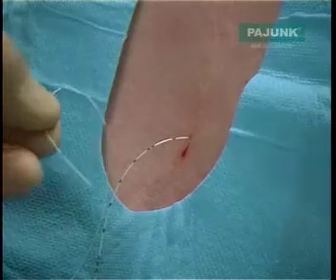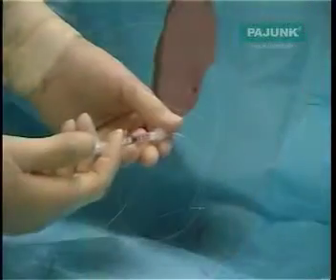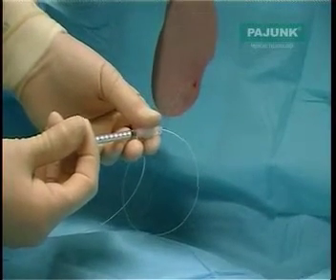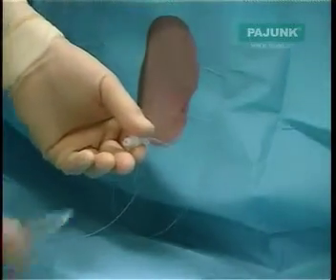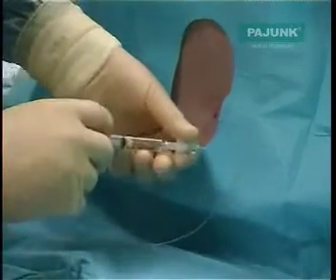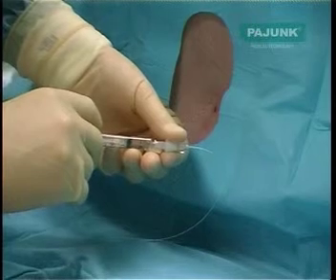In this case you can actually see cerebrospinal fluid draining out of the tip of the catheter, but this isn't actually a constant finding. First of all I inject some opioid down the catheter — here's some diamorphine going in. And then I usually give directly the start-up dose of local anaesthetic. Here I'm using two mils of 0.5% heavy Marcaine, although in a less stable patient you may want to use reduced or incremental doses.